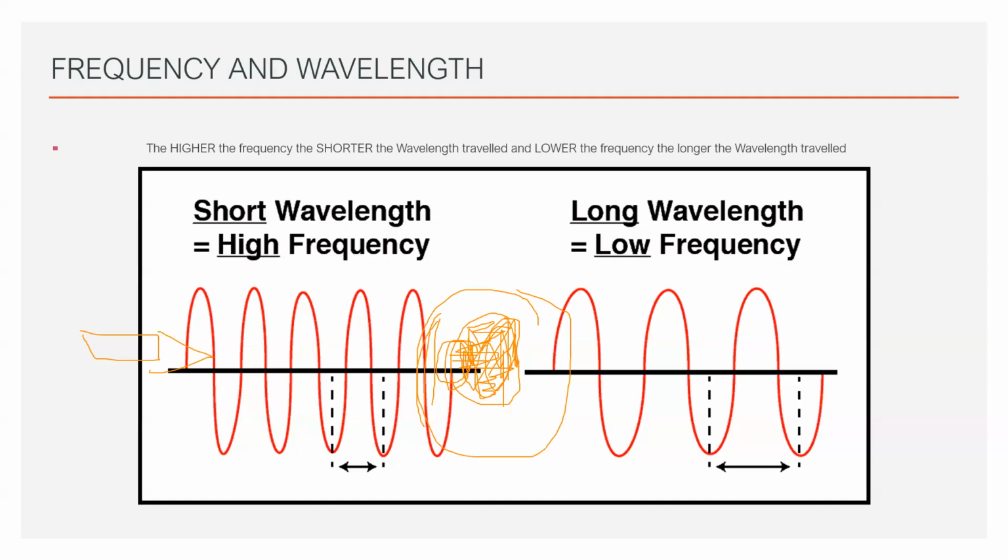And the idea from my perspective at the end of this course is to give you the ability to use a single probe with the frequencies that are engendered in that probe to obtain images that are good quality, that are reasonable enough for you to make a clinical diagnosis with clinical correlation. That is absolutely key. So, a very important aspect of interpreting any kind of ultrasound image is really, why are you doing the scan? What is wrong with the baby? Have you examined the baby and what your clinical correlation is?